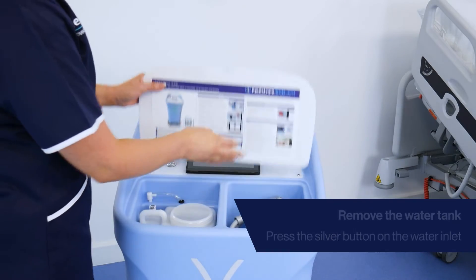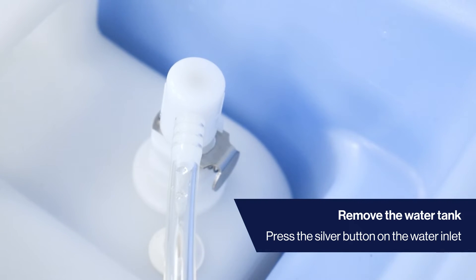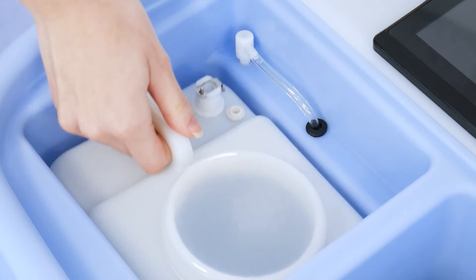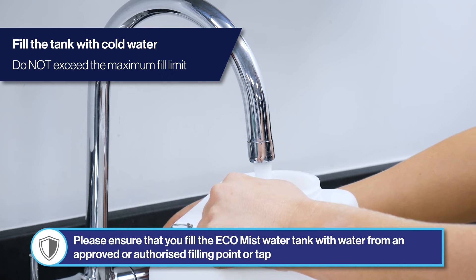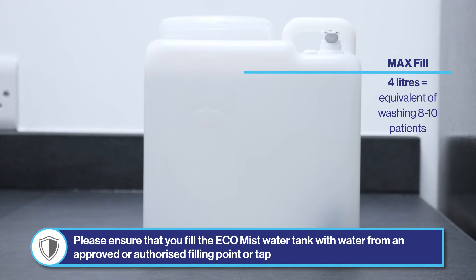Remove the water tank from the EcoMist device by pressing the silver button on the water inlet and unclipping from the device. Unscrew the cap of the water tank and fill with cold water, ensuring the maximum filling limit — marked as 'max' on the tank — is not exceeded.